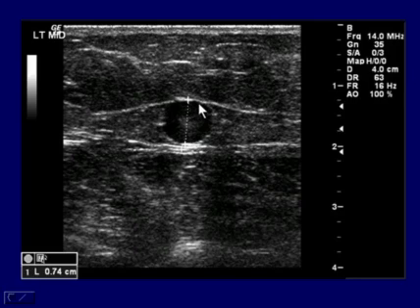This slide illustrates the normal anatomy of the great saphenous vein. It's usually encompassed in a fascial boundary. We can see this bright white line here, which is fascia, and this white line underneath it. So it's sort of wrapped here. And if you look at this, it kind of looks like a little eyeball looking at us here. Here's the eye staring at us, and here's the eyelids. That is the normal planar arrangement of the great saphenous vein.